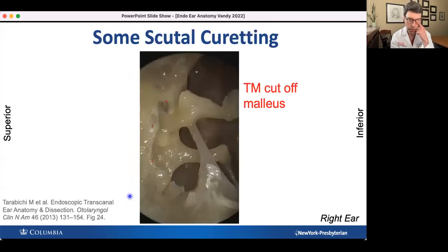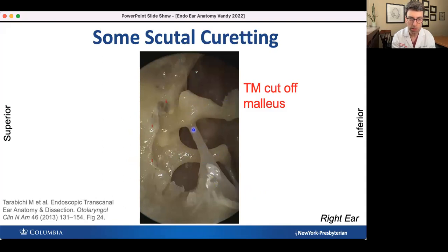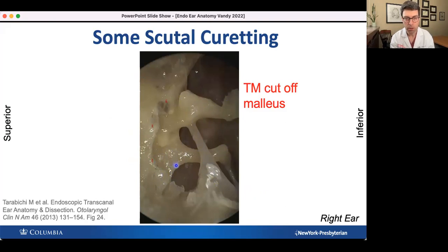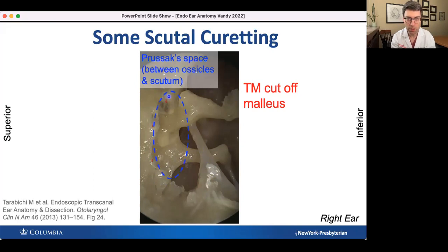If we do a little curetting of the scutum, we can see a lot more into the epitympanum. Here is the malleus, with just a remnant of the tympanic membrane. Parallel to the malleus is the incus — they form a number 11. The chorda tympani nerve always passes lateral to the incus and medial to the malleus. We can see the head and neck of the incus; I always thought it looked like a big nose pointing posteriorly into the antrum. Prussak's space is the space in the epitympanum between the ossicles and the scutum. If you remove the scutum, you can see right into Prussak's space — this is important because it's where cholesteatoma tends to start.